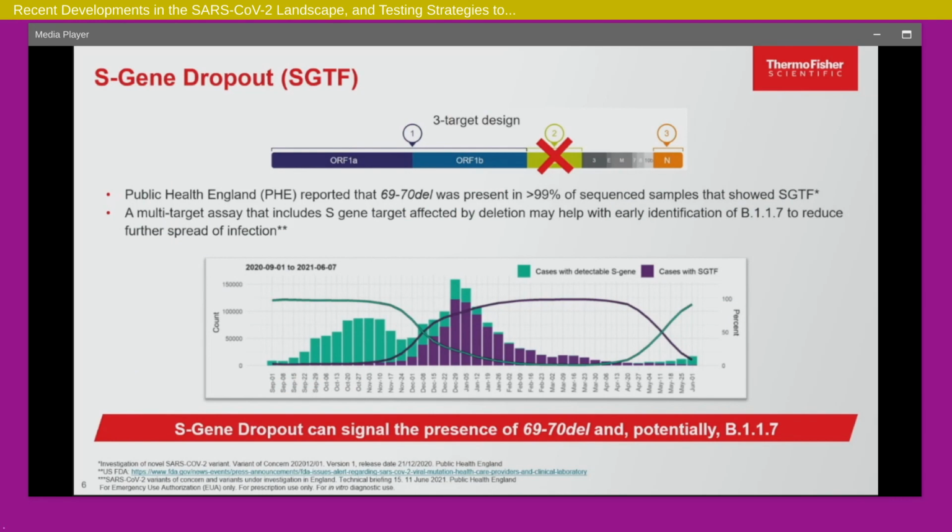You can see this is all the S gene dropout, because this is the detectable S gene. During November and December, the green bars go down and the S gene dropouts come in, which is the S gene target failure. And see what is happening as we move into April, May, June. You can see the S gene coming back. The S gene coming back in the assay was an indicator that maybe something is changing in this virus, where we are not seeing the alpha variant now, and that is something different. And that's where they identified a little bit more.